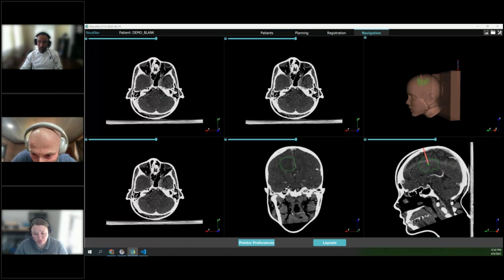Yes. So how this works for 3D Slicer is that 3D Slicer itself bundles its own Python interpreter. It is mainly a C++ application, so Qt C++, and it bundles along with it, as part of its binary install, its own Python interpreter that it uses during runtime to interpret Python files and run the Python half of its application. So it's not bundled as a Python app. It's a C++ application that brings a Python interpreter along with it. And this is one of the things that we're looking to change with the modularization approach.